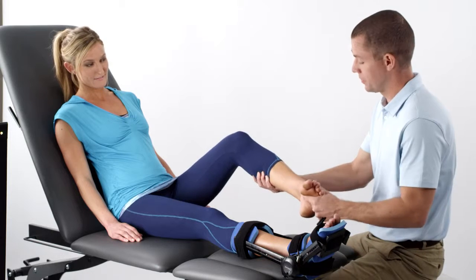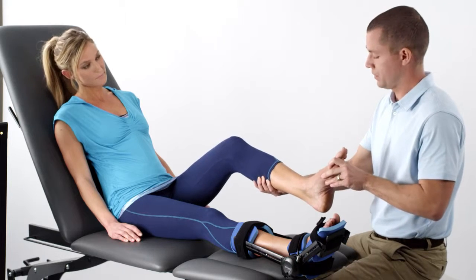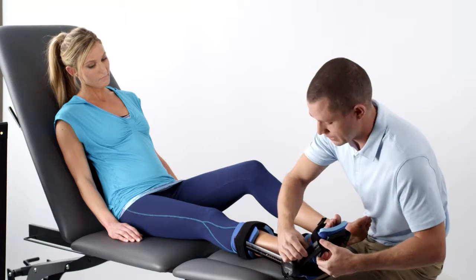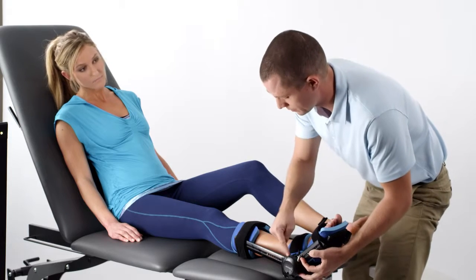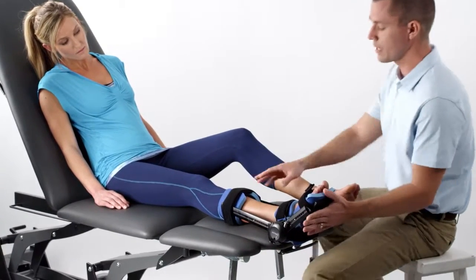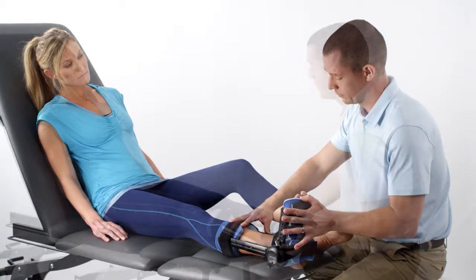Since inversion often accompanies an ankle plantar flexion contracture, the following guidelines may be used to help encourage movement out of inversion. Shorten the lateral strut on the front plate cradle and/or increase the tension on the lateral tension spring. When you need to address complex ankle contractures, the combination of these forces will help to promote proper foot positioning.